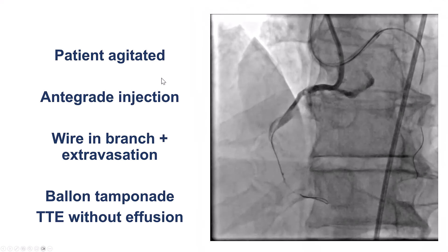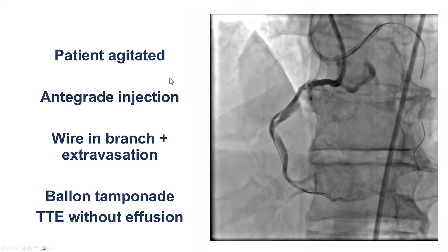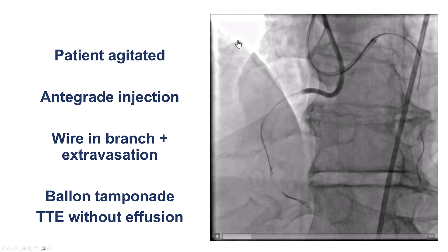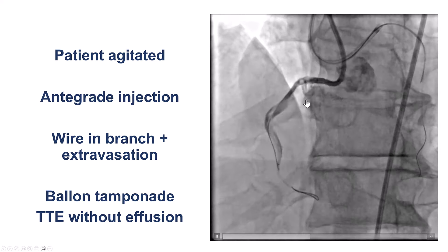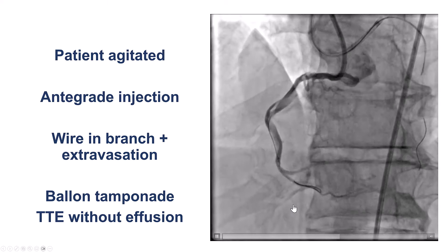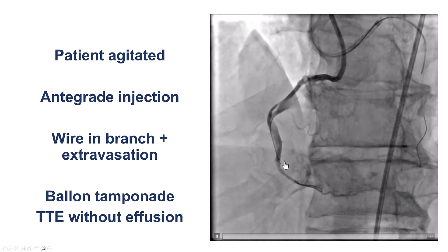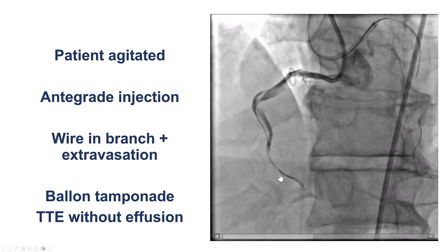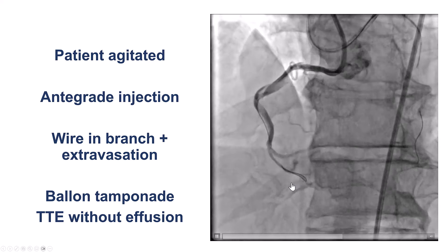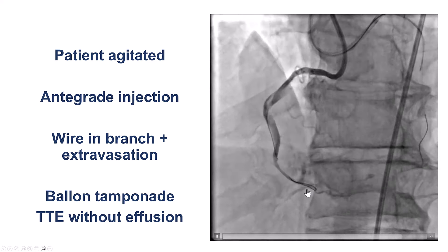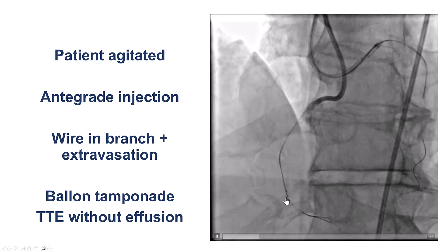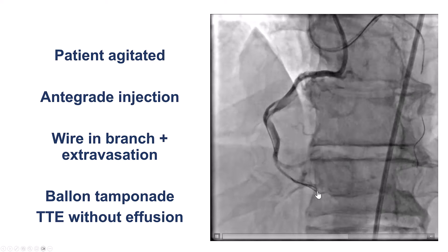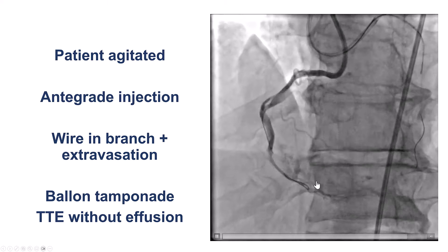At this point the patient did become agitated and we were a little concerned whether we had an issue, so we did a brief contrast injection, which of course destroys the options for reentry. What it showed us is that we were actually not into the distal RCA, but our stingray balloon was more into an acute marginal branch, and our attempts to cross had caused a small contrast extravasation into this acute marginal branch.